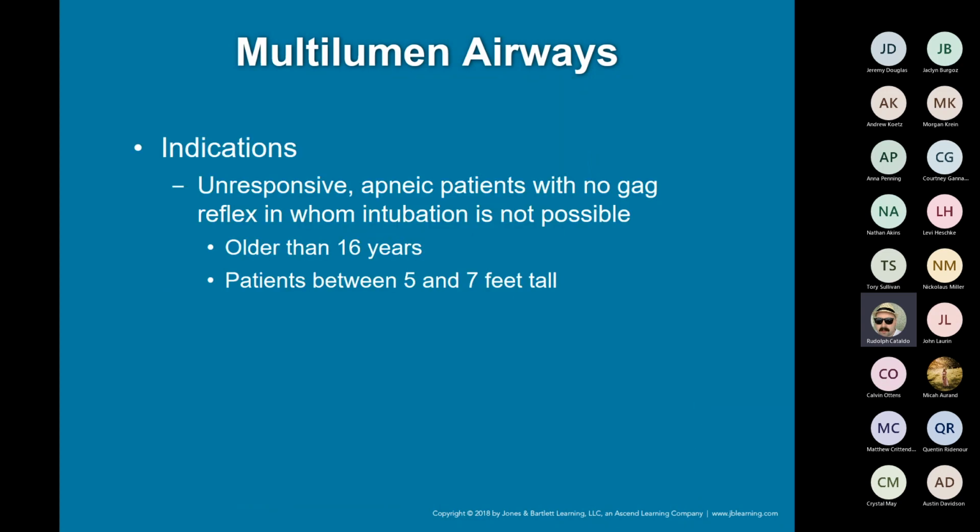I don't know anybody that carries combi tubes anymore. They went by the wayside. It seemed like 10 years ago almost.